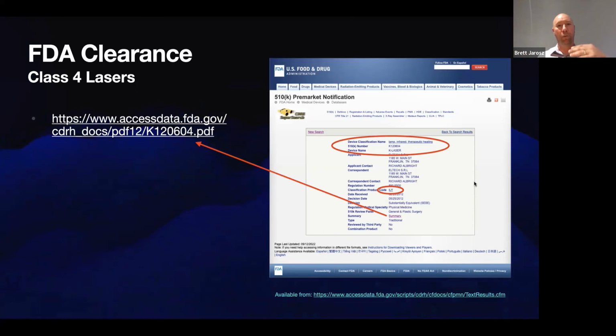I don't want to get into the concept here of how the decision was made, substantially equivalent. You can either do the research, or you can have a product that already exists and copy the specifics of it and put in an application for clearance based on being substantially equivalent to a device that already exists. So there's our basic differences when we look at FDA clearance.